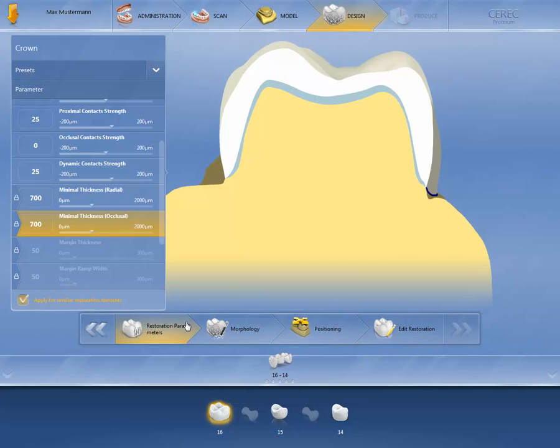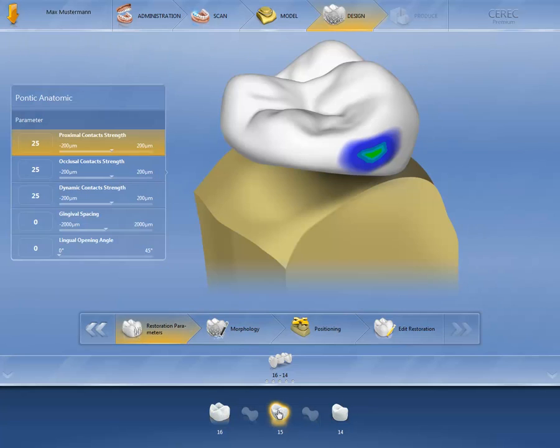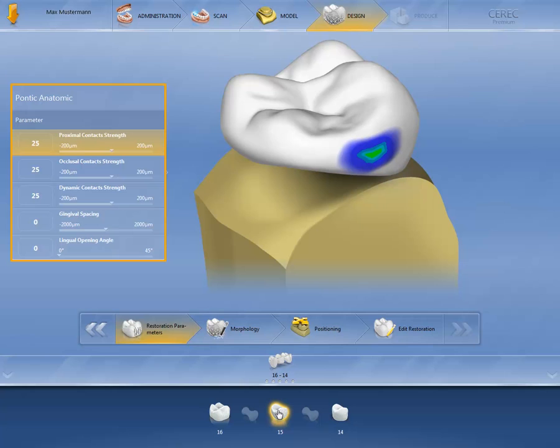Select whatever further elements you wish to set the parameters for in the restoration selector. In our example, we now adapt the parameters for the pontic. Depending on the parameters selected, the view on the pontic also changes.